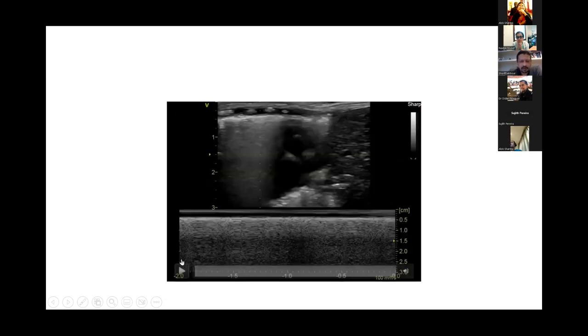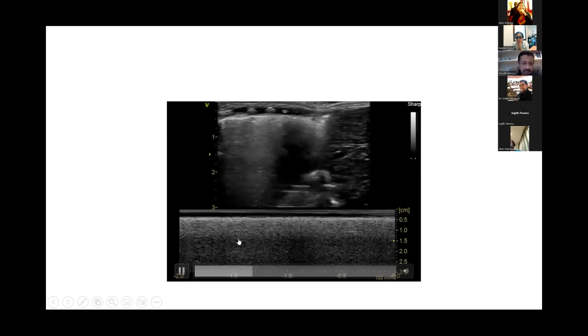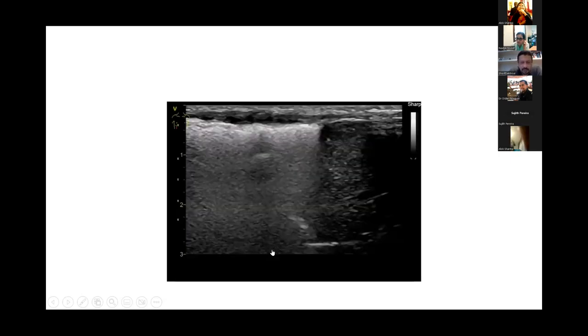I complete my presentation, but I would like to mention something. I put the M mode. I'm still at R1, which I can see clearly here. I can see the heart coming on the way, but I could appreciate also some pleural sliding. In the M mode here, I could see a mix of barcode and sandy beach sign, which I don't have an explanation for. I could see pleural sliding, and I tried to repeat it, putting the cursor in many areas, but it just gave me the same picture of a mixture between barcode and seashore sign. Sharif, can I comment on that?